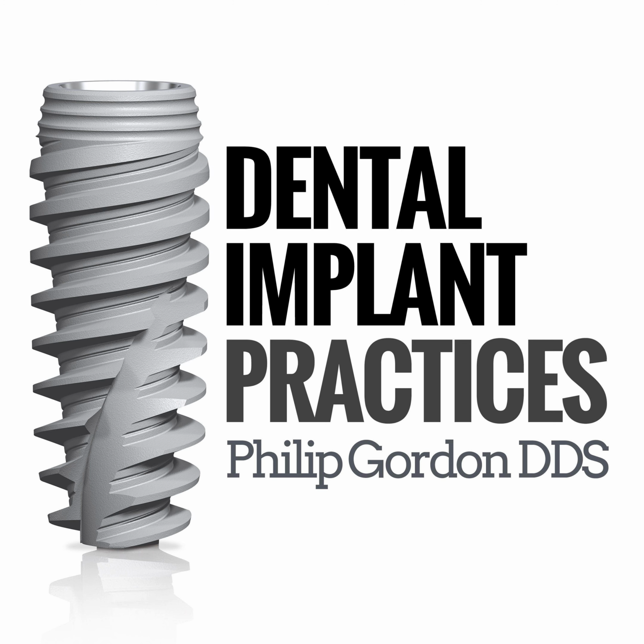And then, of course, I have some referrals who are basically prosthodontists, and all they want is a healing abutment, and then my job is done. But I have others who want me to put an abutment on the implant for them. And so for those dentists, we're actually creating custom abutments for them with CEREC, and then letting them do the final restoration. So I'm using all the capabilities of both the CAD-CAM and the cone beam together.